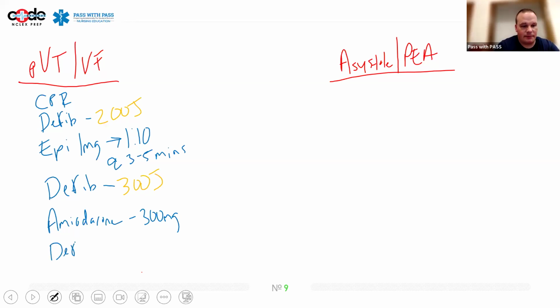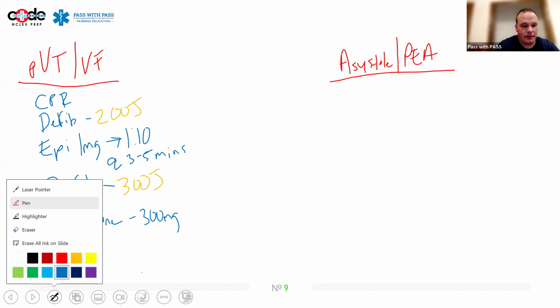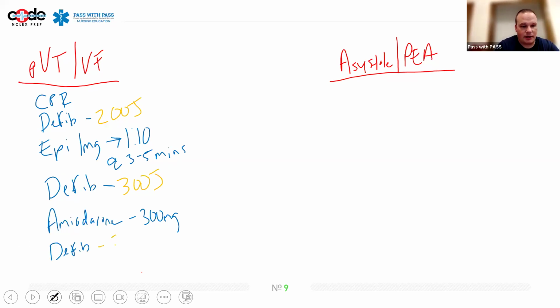Our 2 minutes is up. We're going to shock at 360 joules. And then for all subsequent defibrillations, we're going to shock at 360 joules. It doesn't go up from there. For LifePak 15, the manufacturer's recommendations are 200, 300, 360. And then we just continue to defibrillate at 360, 360, 360, 360. So I won't repeat that continuing on. So we'll defibrillate at 360.